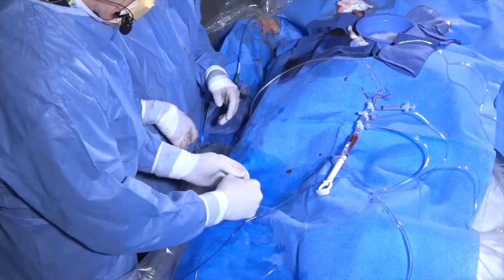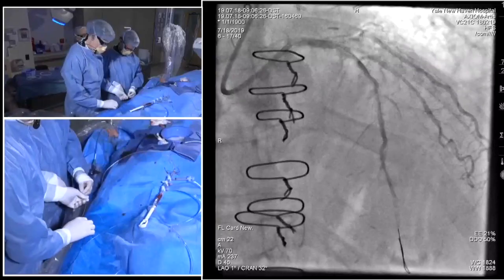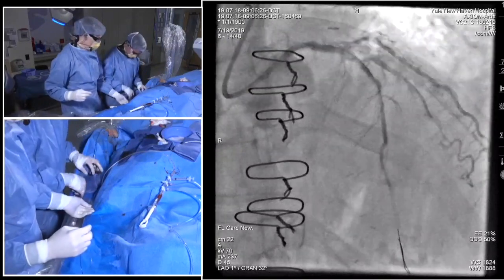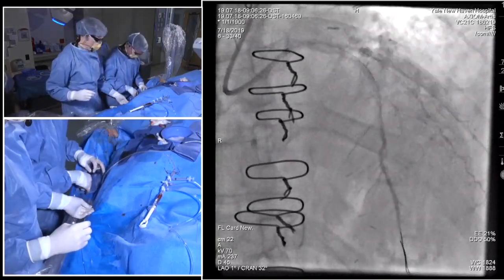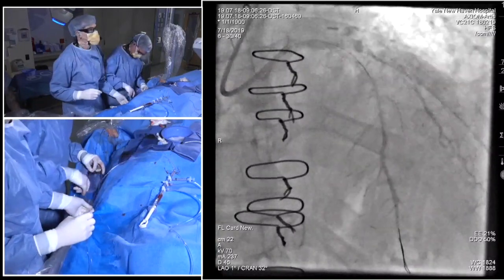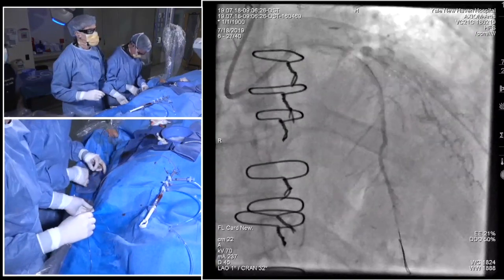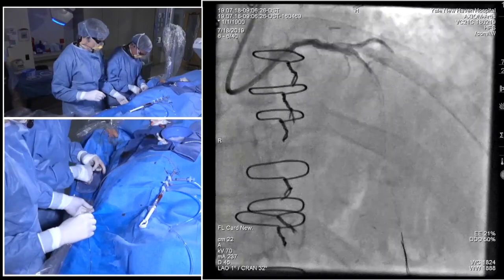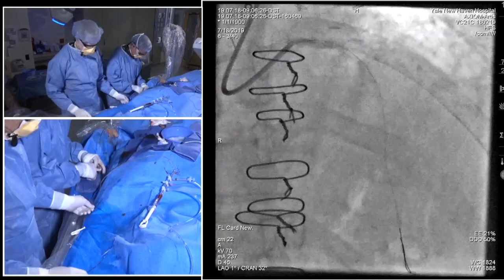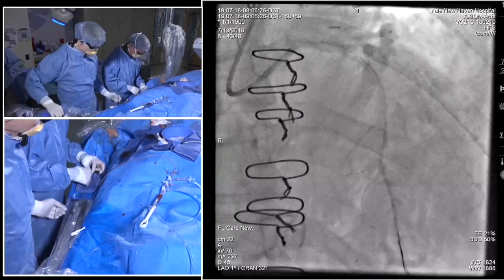So we just wanted to be clear. You can see, if you look at the angio carefully, there's a segment just distal to the calcification that runs intramyocardial, and the vessel walls there get pretty thin in general. So we just wanted to make sure where we wanted to land stuff before we started ballooning, in fear of dissecting it with a stent. So we're just going to run down really quickly and do this, and then we'll post-dilate it with a 2.5 non-compliant.